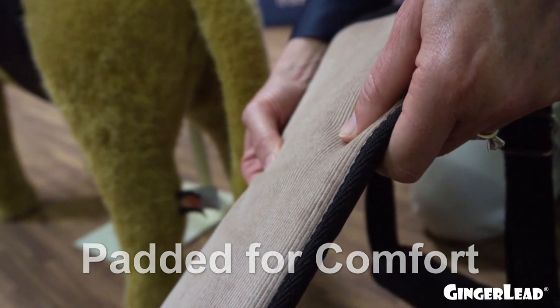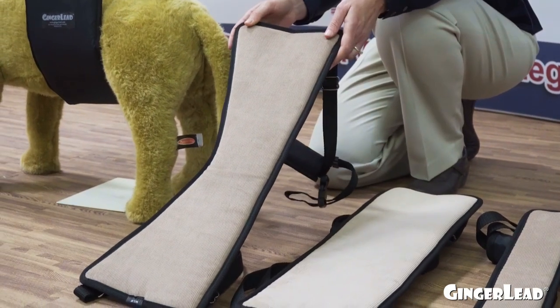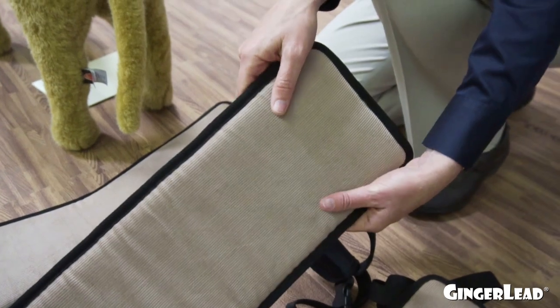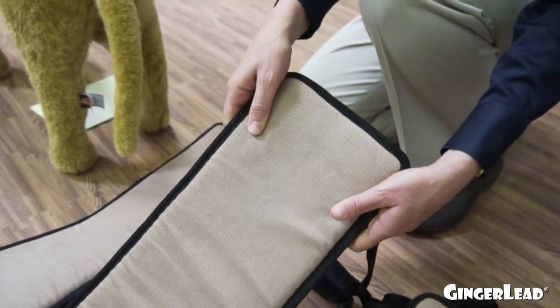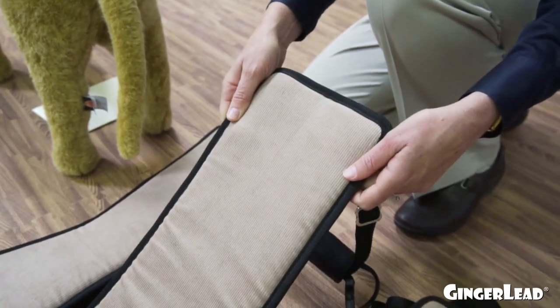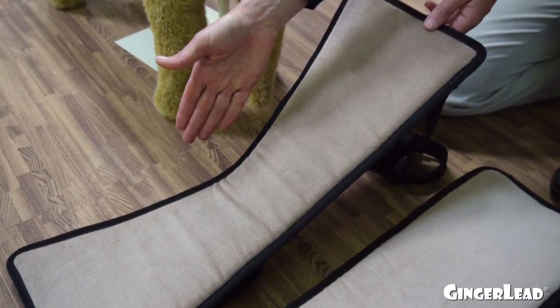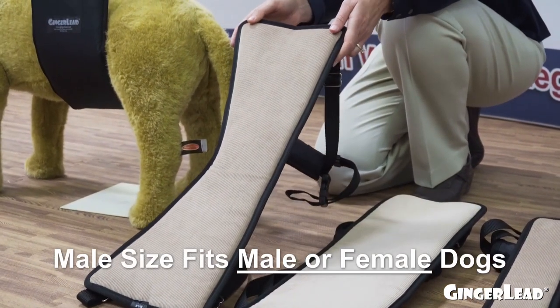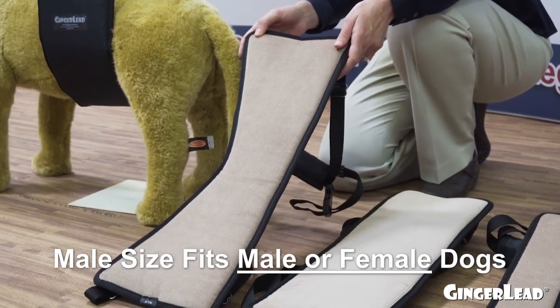The harnesses are nice and soft and padded for the dog's comfort. We have male and female support pads. The female support pads are rectangular with a nice soft corduroy against the dog's belly and don't bunch up. The male support pads have a cutout and also have the soft corduroy and padding — we also call them unisex because they can be used on male or female dogs.